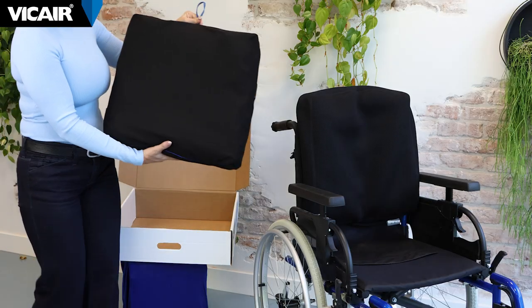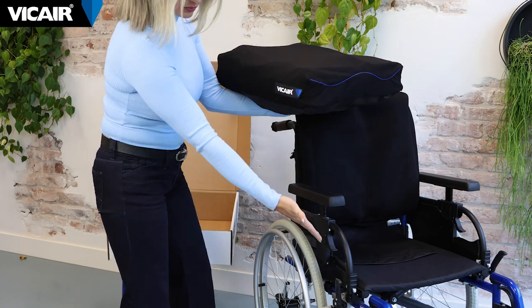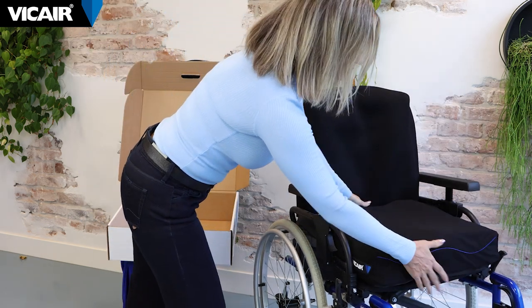The Vicair O2 wheelchair cushions can be used right out of the box for the majority of wheelchair users. There is no pump or additional equipment needed.